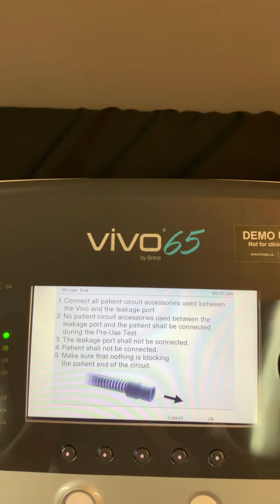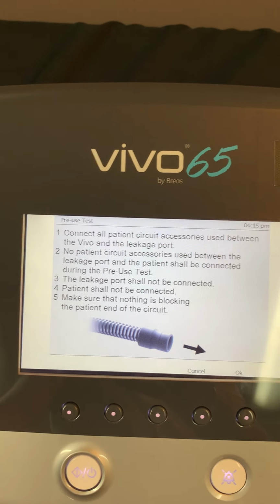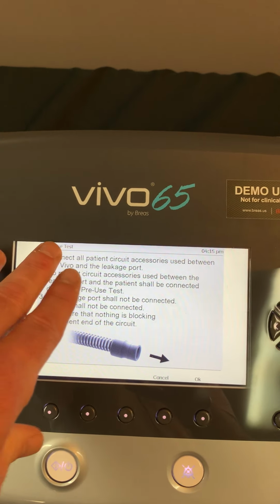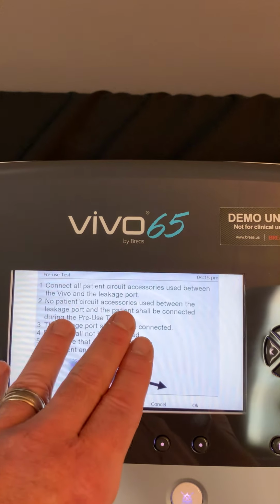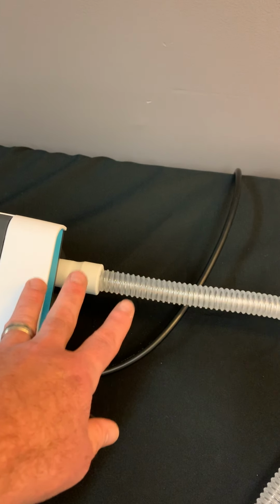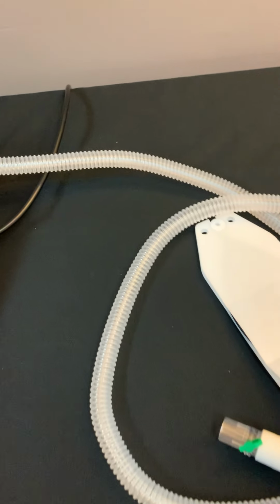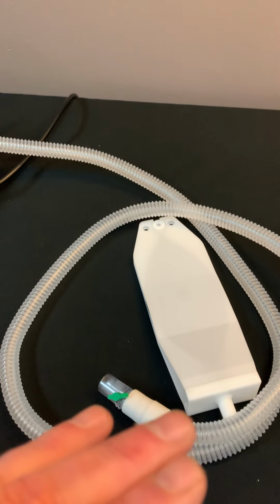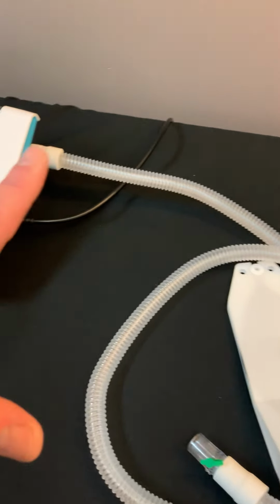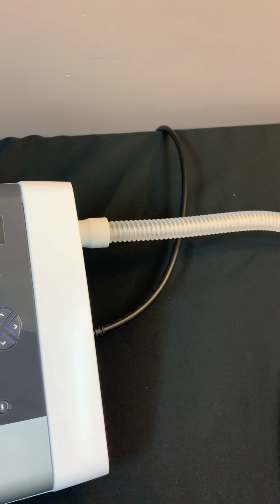Okay, so now there's a list of instructions here that have to be followed. Number one, you want to make sure that all the patient circuit accessories that are used between the Vivo and the leakage port are connected. So if you're using a bacteria filter or an external FiO2, or an active humidification source, anything that contains volume, you want to make sure that all that is connected so that the ventilator is compensating for what you have connected to the machine.